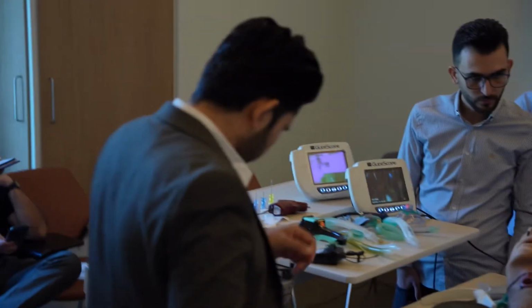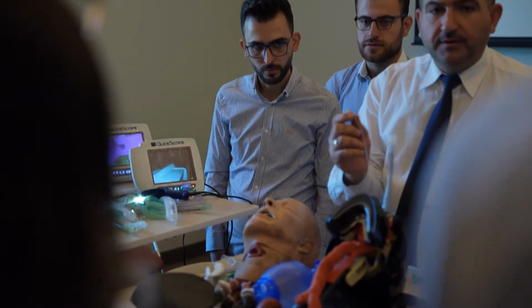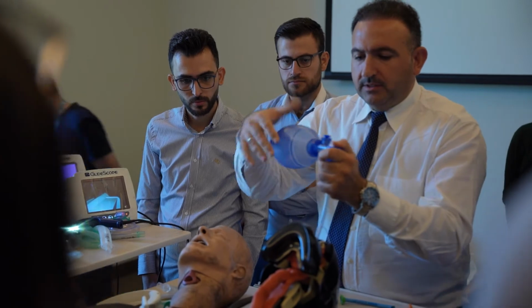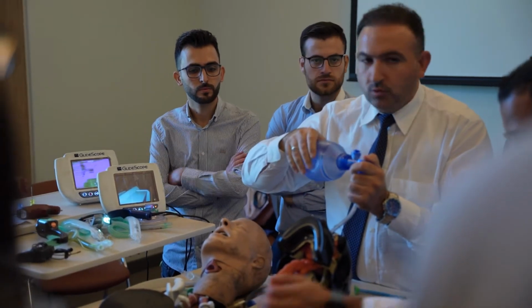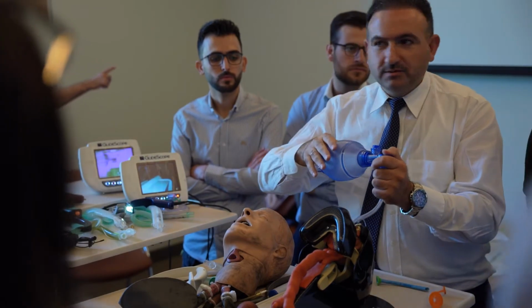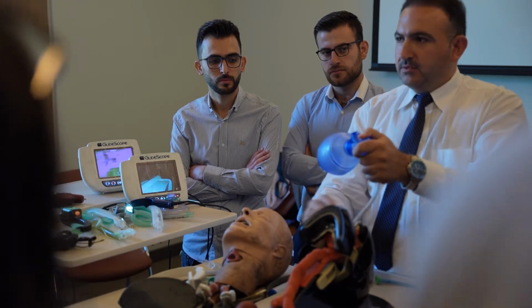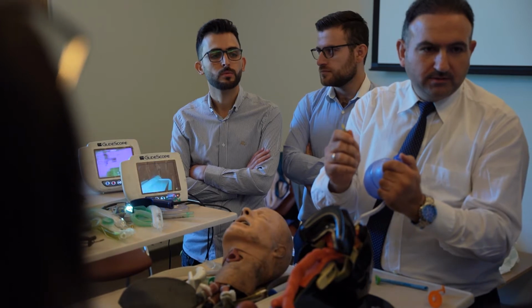After that, how do we know we are in position? We should auscultate the chest. But we should inflate the cuff first to fix it, then push air inside and check bilaterally by stethoscope, to see if the breath sounds are equal or not. Sometimes the tube slips into one bronchus. So what do we do in that case? We pull it back a bit, then recheck. Don't forget to deflate and inflate. Yes, exactly.